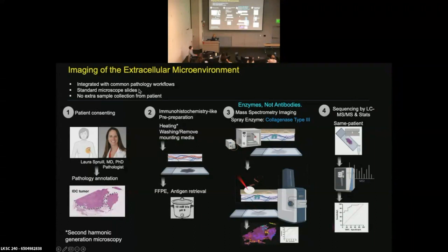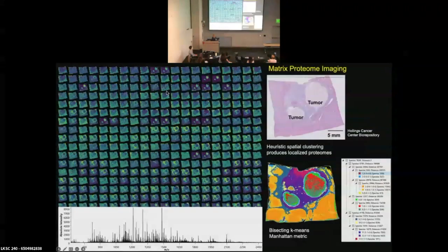Importantly, it's integrated with common pathology workflows. It uses standard microscope slides. There's no extra sample collection from the patient. And so this is an example of what we might get.